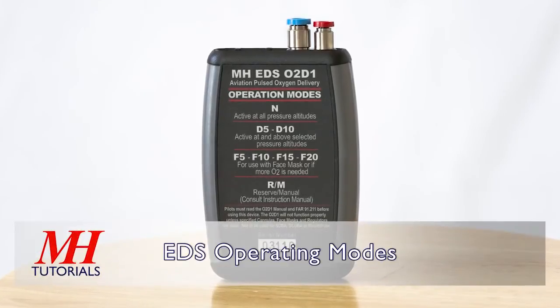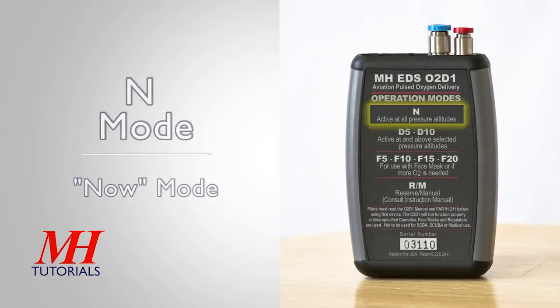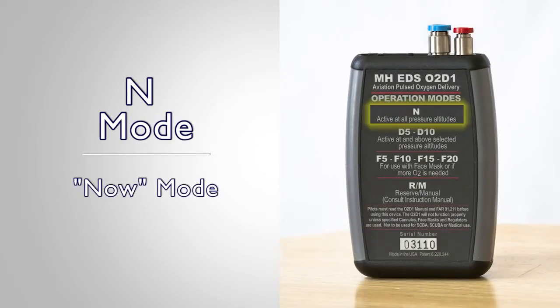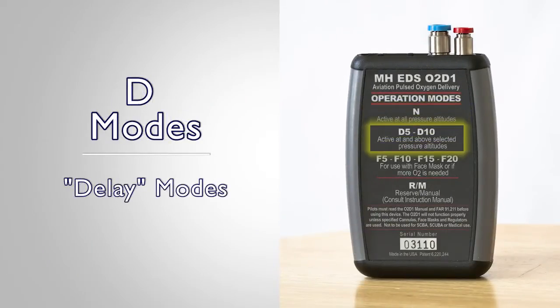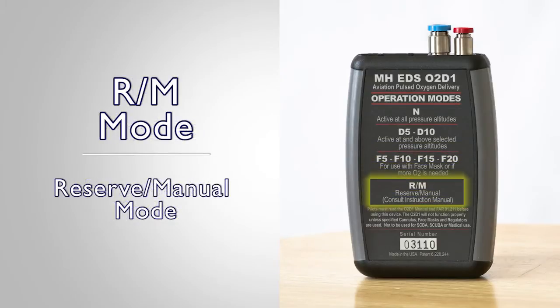The Mountain High EDS Pulse Demand Oxygen System has four modes of operation: N or Now Mode; D5 and D10, the Delay Modes; F5, F10, F15, and F20, the Face Mask Modes; and the Reserve/Manual Mode.